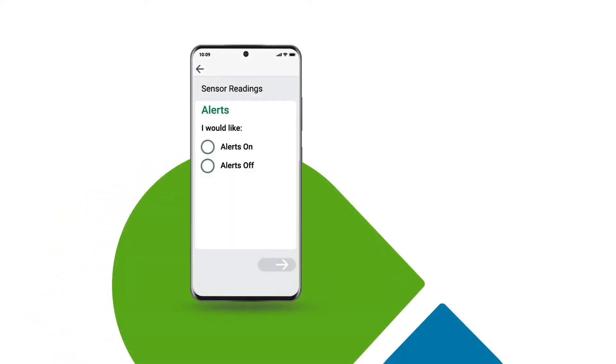Dexcom One offers alerts that let you know when your glucose has gone too high or low. You will come to a screen where you can turn these alerts on or off. Let's turn the alerts on. You always have the option to turn them off later.